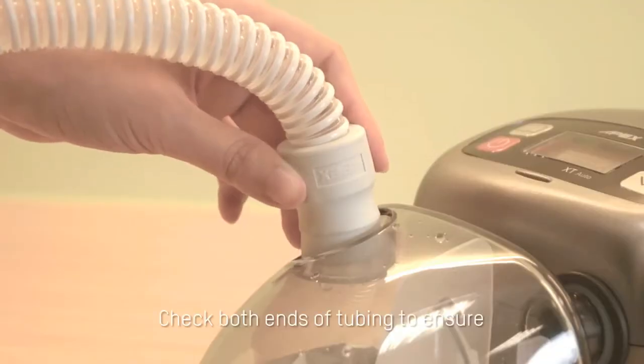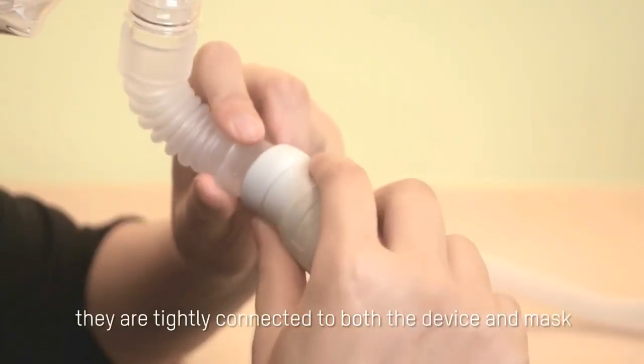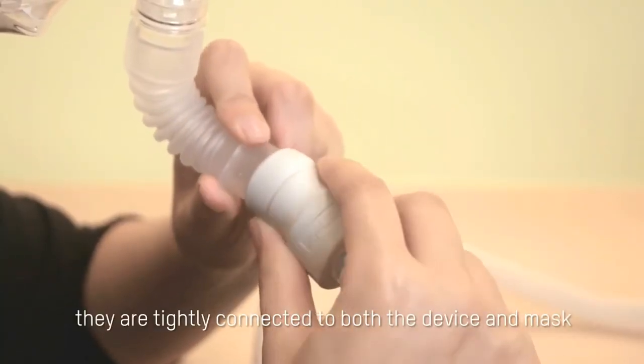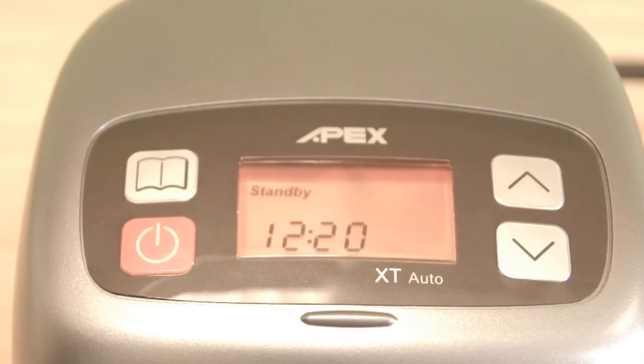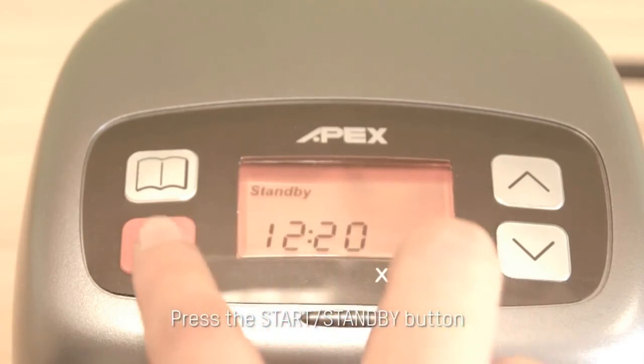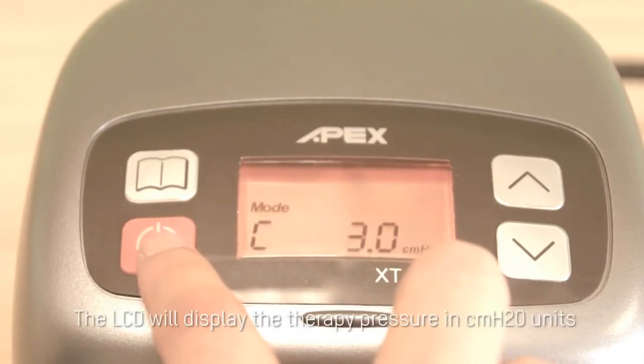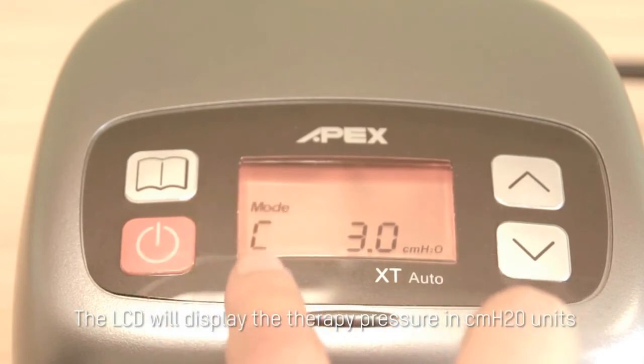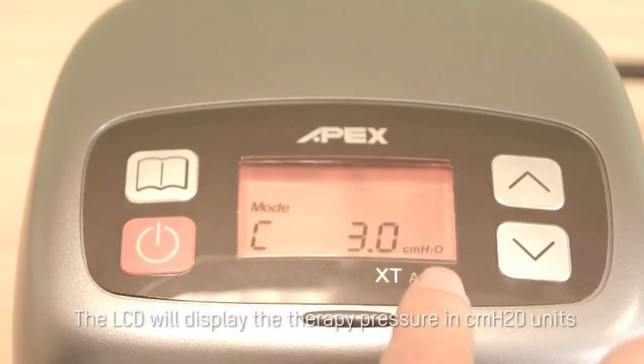Check both ends of tubing to ensure they are tightly connected to both the device and mask. Press the start standby button. The LCD will display the therapy pressure in CMH2O units.